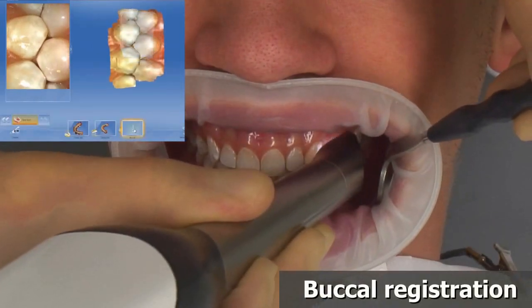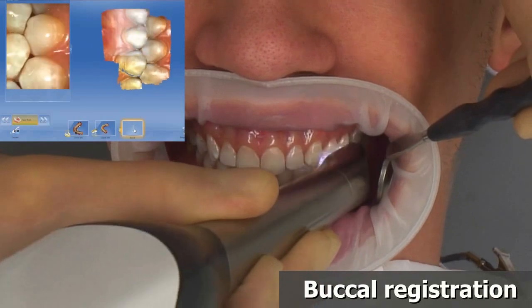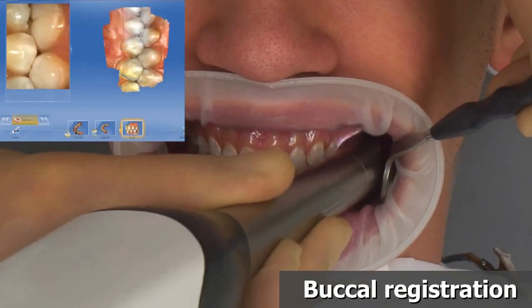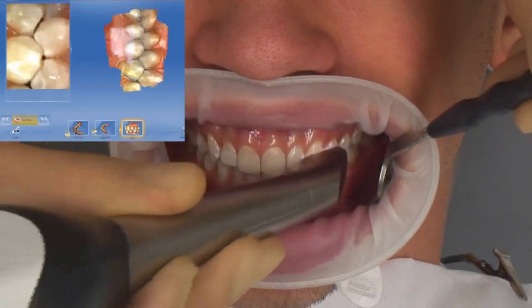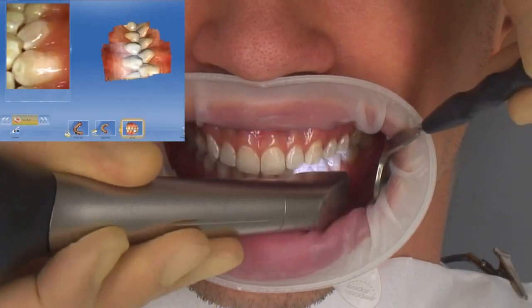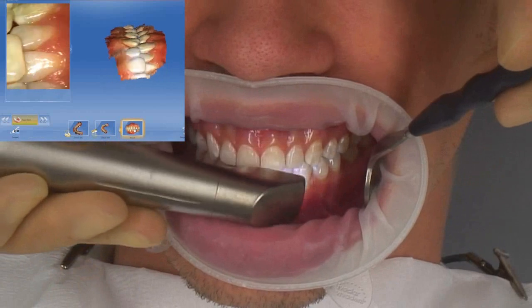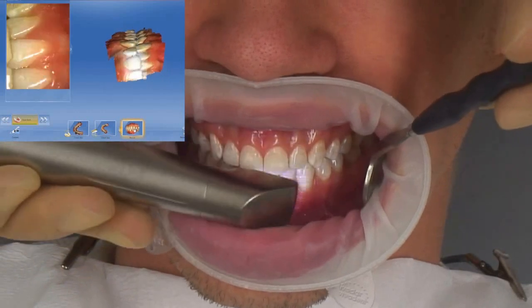For the buccal registration of the lower and upper jaws, carry out a scan of the buccal bite registration.